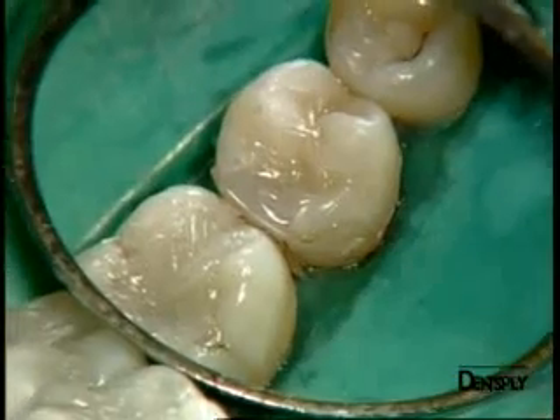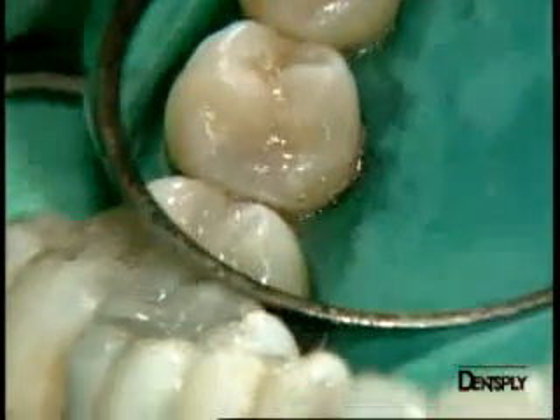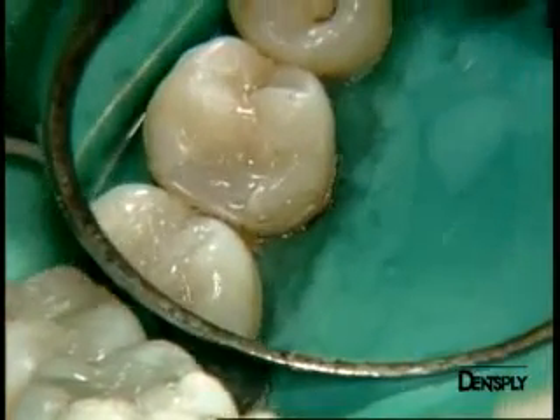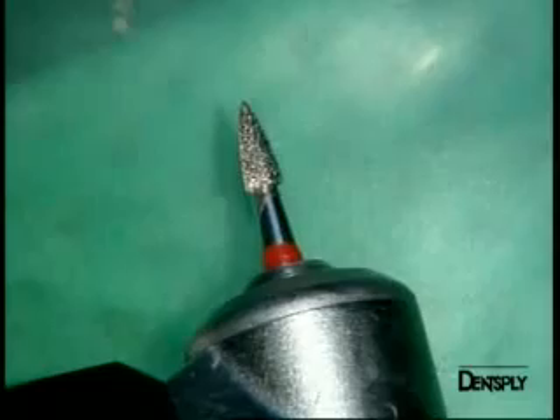Also, Quicksville does not belong to the packable composite materials, yet you can see that one can still achieve excellent contact points. We will check this contact point later using silk floss.